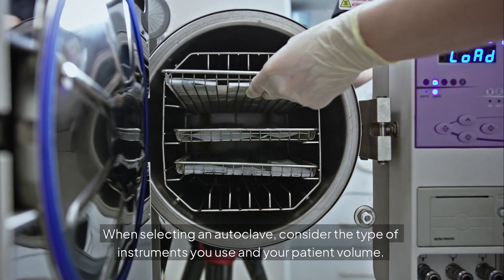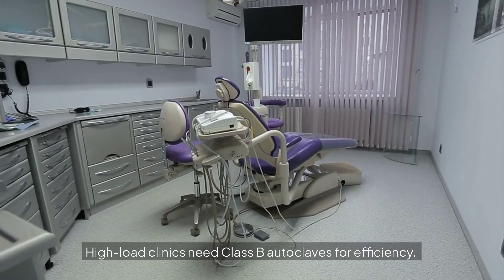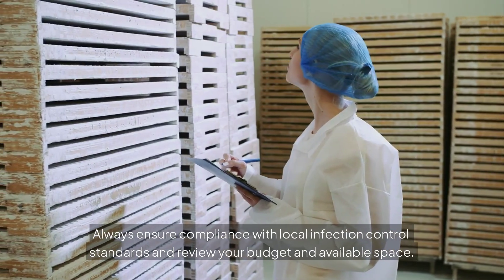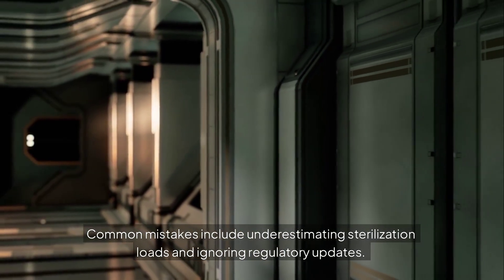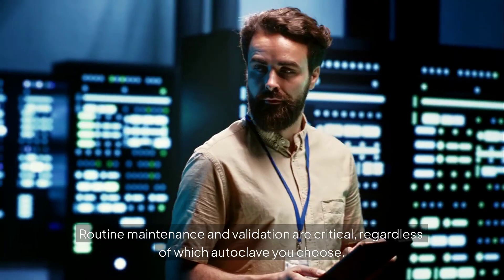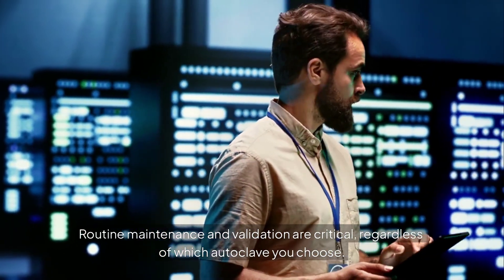When selecting an autoclave, consider the type of instruments you use and your patient volume. High-load clinics need Class B autoclaves for efficiency. Always ensure compliance with local infection control standards and review your budget and available space. Common mistakes include underestimating sterilization loads and ignoring regulatory updates. Routine maintenance and validation are critical, regardless of which autoclave you choose.